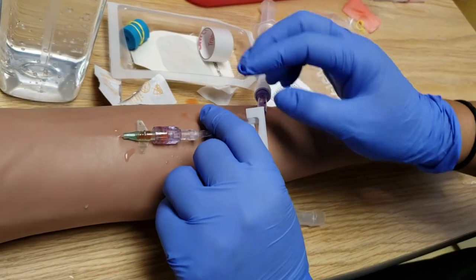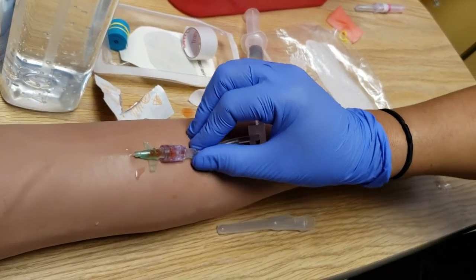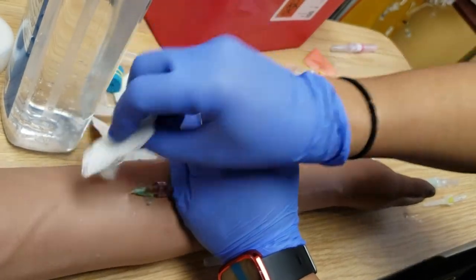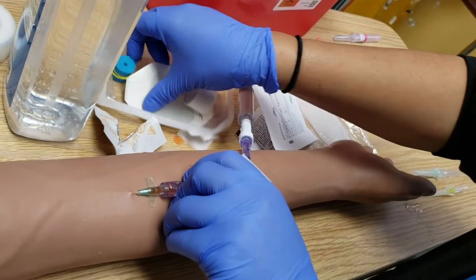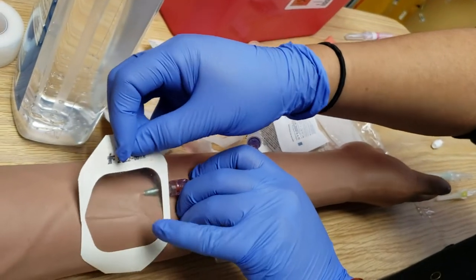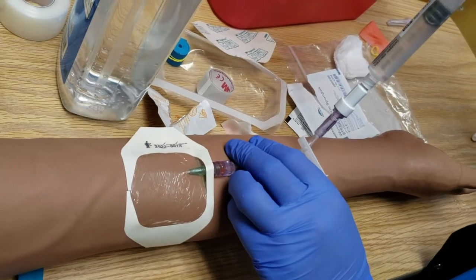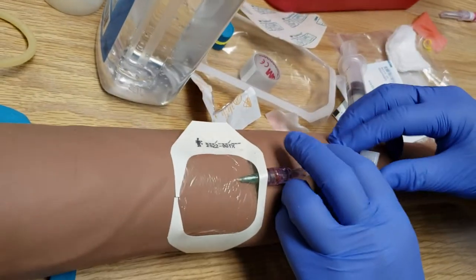Now you don't want to let go of this — make sure that's stable. I'm going to dry that so my op-site will just stick on there. Now what we're going to do: stick the op-site and put it on top. At least that's stable now. Now we're going to flush — I'm going to flush half. It looks okay. I'm flushing it easily. There's no bubbling, swelling, or anything on there.